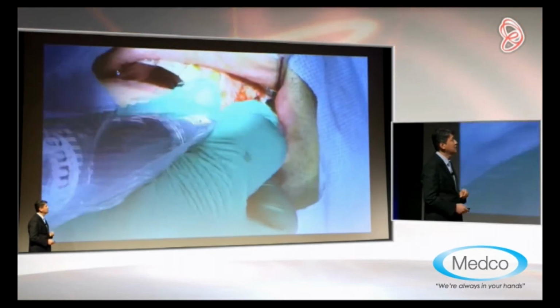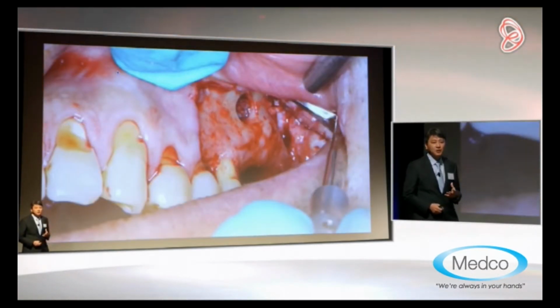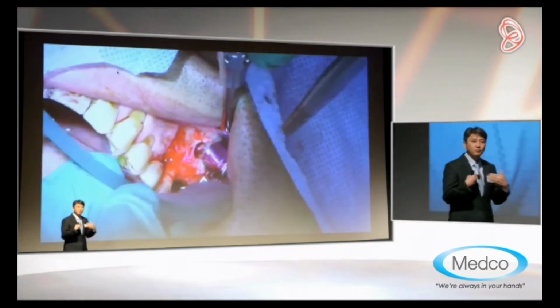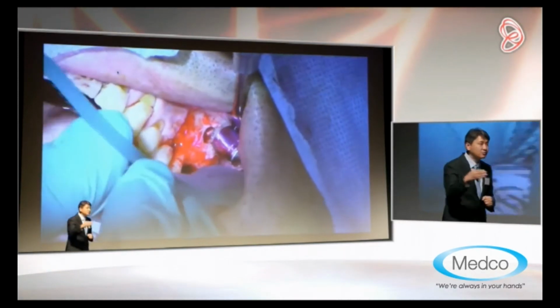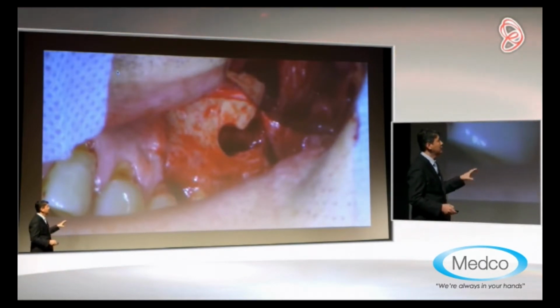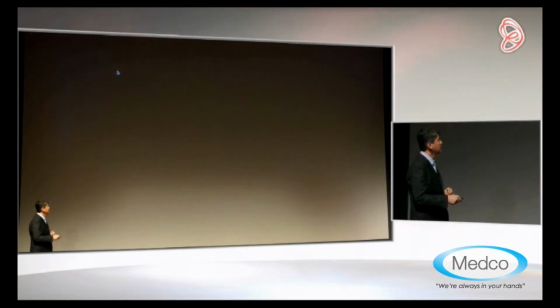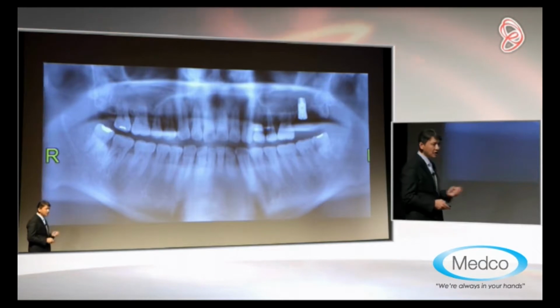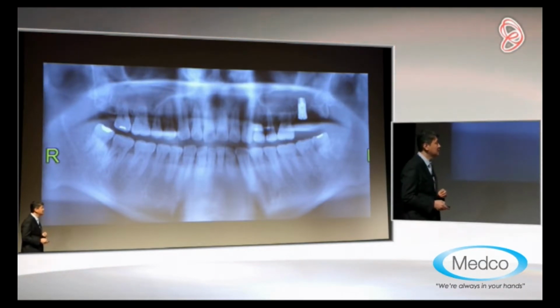So as you can see, we try to perforate, but it's almost impossible to perforate because the water will protect the membrane as we are drilling. And we will verify the membrane is intact, and we will inject bone, and we can have a very predictable sinus lift outcome.